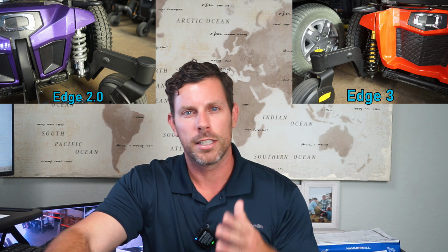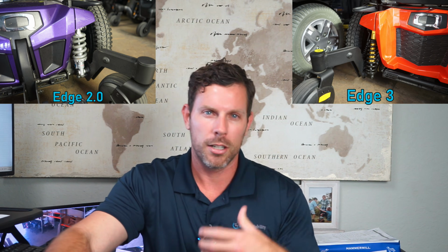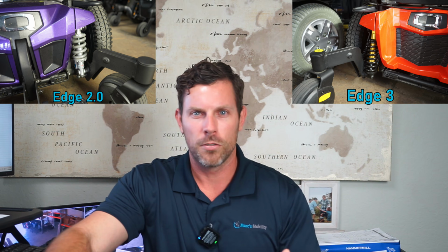And then also on the Edge 3, Quantum actually met with Motocross to design the suspension, so you will see that on the Edge 2.0 it's silver looking shocks. On the Edge 3 it's a gold looking shock, so that gold shock is when they met with Motocross to design that specifically for the vibration and the user overall feel of the unit. That is going to be some of the differences between those two units. There are other minor differences such as wheel inserts and a few other things like colors, but those are going to be the primary differences.